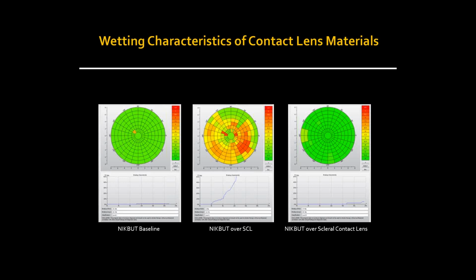Typically it's easy to be behind an ocular and apply fluorescein to a GP lens on eye, and you can see how the tear coats over the surface of that contact lens. But you can't necessarily do that over top of a soft contact lens. You'll potentially stain that patient's contact lens, and they have to go home with it. With the tear breakup time tool on the keratograph, we can see here that the integrity of the tear passing over the soft contact lens surface is not that great in this case. We can apply the same methodology over a scleral contact lens, and you can see that the tear breakup time in this case is much longer, and in fact the integrity of the tear over top of the contact lens works well. Now for this patient, does that mean that scleral lenses are the go-to choice? Perhaps, or it means nothing. It just helps us understand better, if a patient comes in and they're symptomatic, how we can best provide them with a contact lens that can improve their quality of success over time.